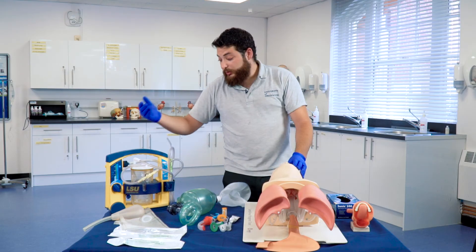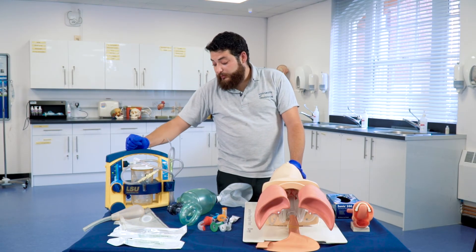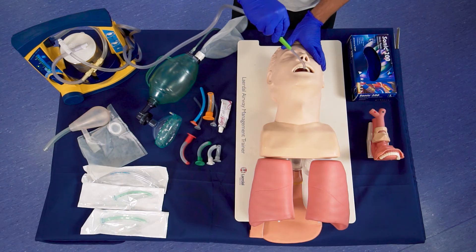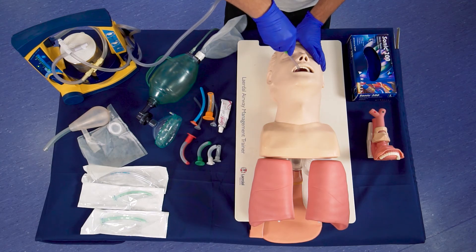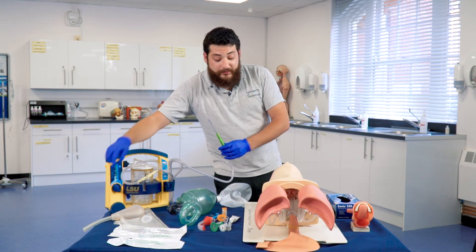In the case that the patient does require suctioning, we will be using the electrical or the manual. To do so, we turn the electrical machine on — it has a valve over here to create a vacuum. It is important that when you insert the suctioning unit, you do not cover the hole until you're in the mouth. Once you're in, then you create a seal, create a vacuum, and you suction in a figure of eight outwards. Never suction further than what you actually can see, as this will cause problems later on if you lodge something further in.